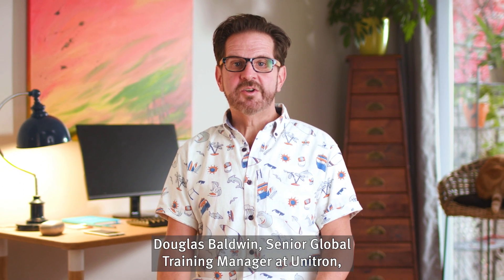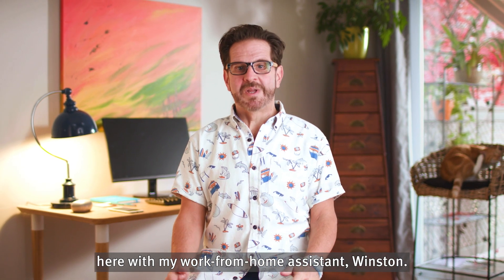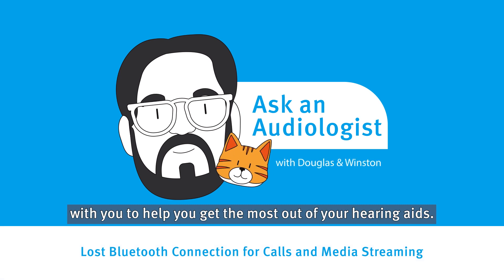Hi there, Douglas Baldwin, Senior Global Training Manager at Unitron, here with my work from home assistant, Winston. We want to share some useful troubleshooting tips with you to help you get the most out of your hearing aids.